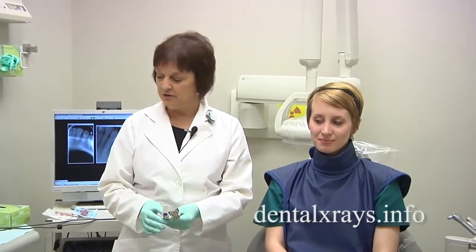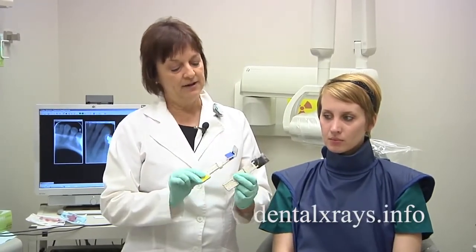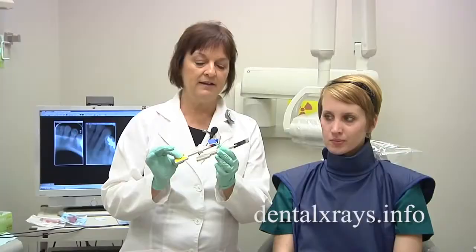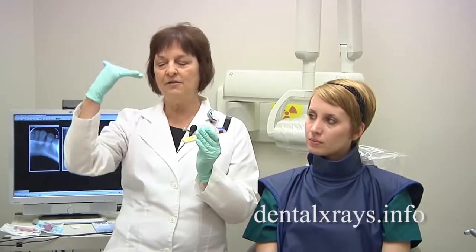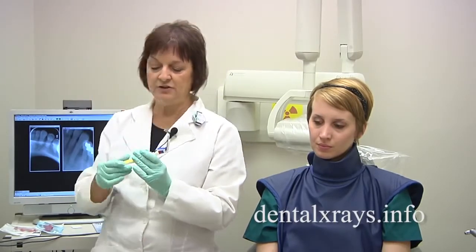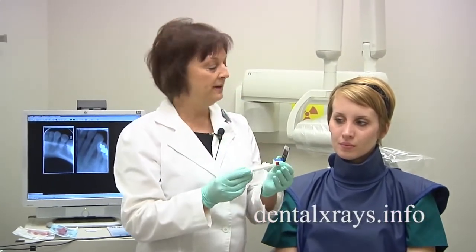Another option besides the ring instruments for the anterior teeth is the bisecting angle — it's a different holder. There are different varieties depending on what you have; one has a little curved edge, this one is straight, but both work very well. This one is great because it makes it easier for you in getting the correct vertical tube angle. You've got to remember that the vertical tube angle — the up and down — is going to cause your elongation or foreshortening of your images, so you really have to make sure that's correct.